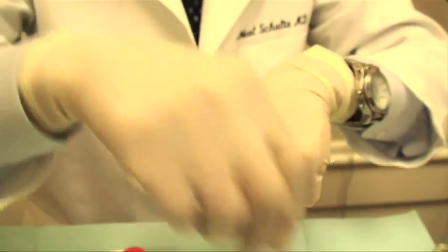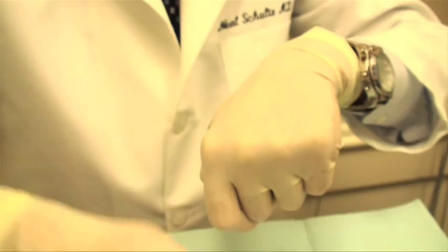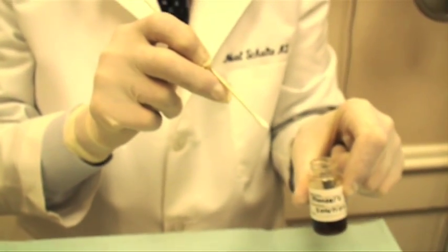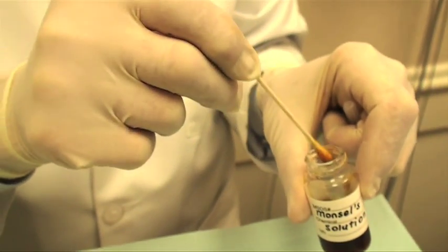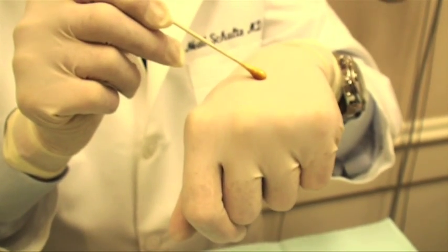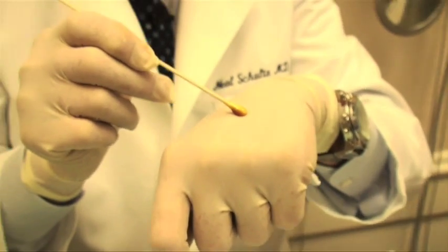Obviously there's a small amount of bleeding, so we use gauze to control the bleeding, and then we take a special liquid called Monsel's solution, which is an iron compound. On a Q-tip, we take some of that iron compound and we touch it to the skin where it's bleeding, and the iron causes the blood to clot. It's a little bit like an advanced or stronger styptic pencil that people use to stop nicks from bleeding after they've shaved.